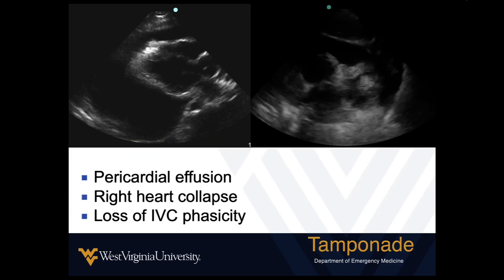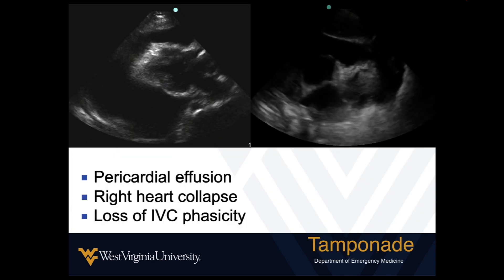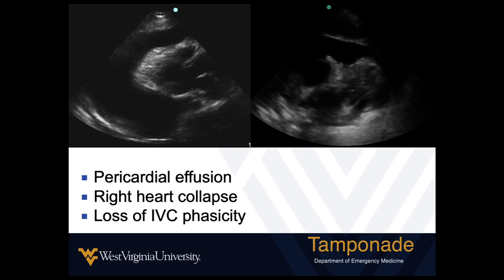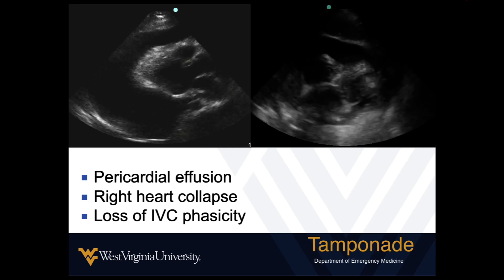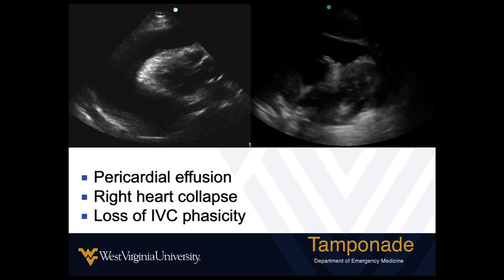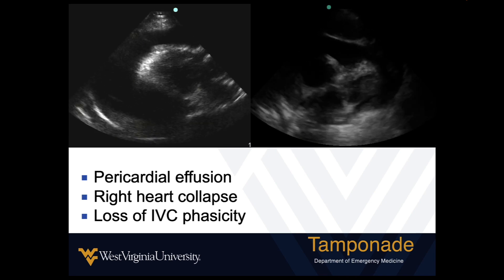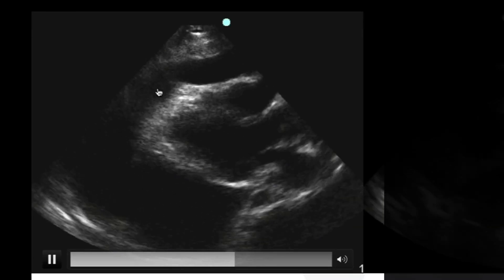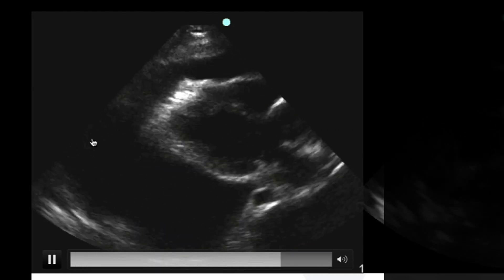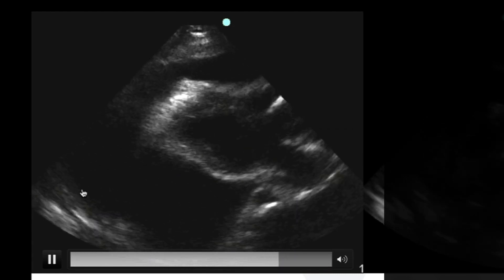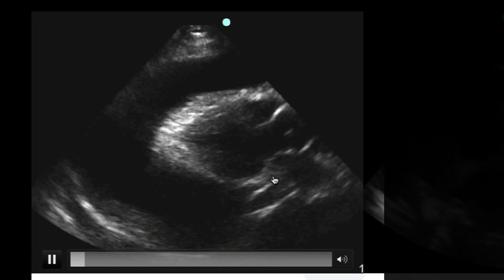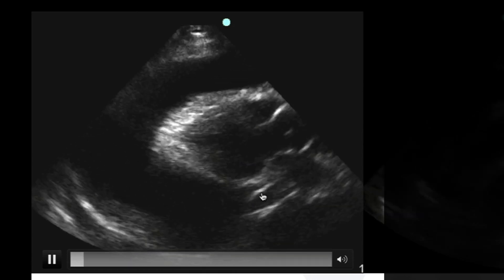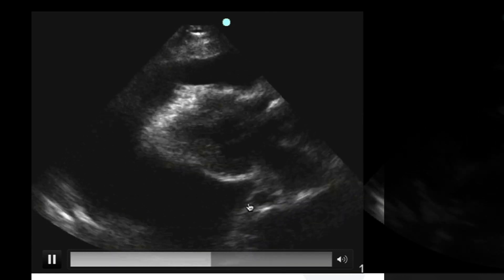The next form of obstructive shock is cardiac tamponade. One of the main findings is a pericardial fluid collection — it may be fluid, blood, or pus. In this case it's simple fluid, and we see a large collection. In the parasternal long axis view, this fluid collection pinches up between the left atrium and the descending thoracic aorta, which is a very important landmark.